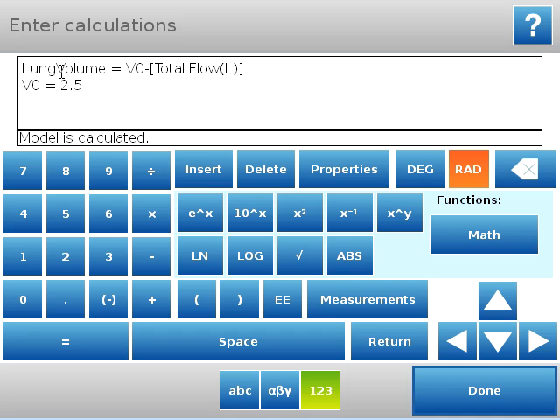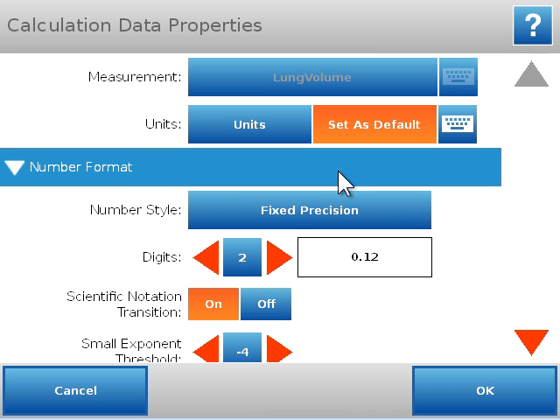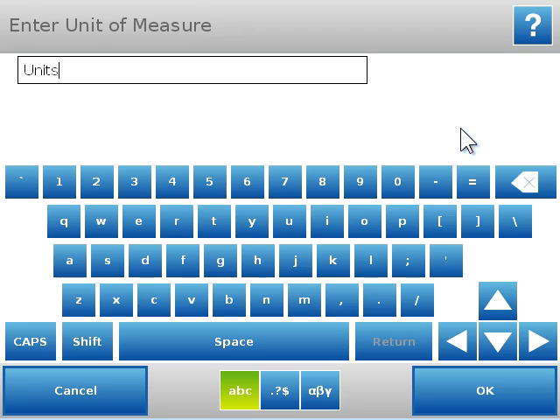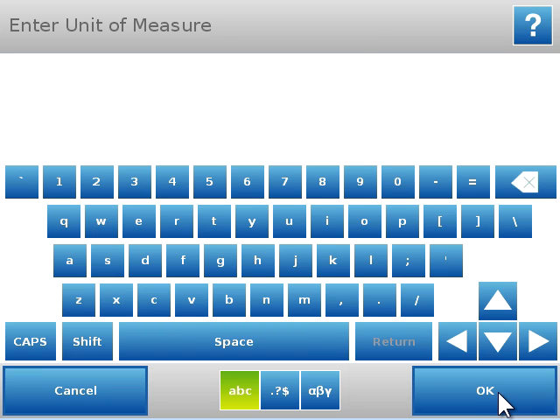Notice I did not put a space between lung and volume. The name that you give your calculation needs to be all one word. I'm going to click back up next to total flow, and I want my lung volume to be in liters. So I need to define that as the property of this calculation. So you can see lung volume as my measurement. I'm going to click the keyboard for units, and I'm going to replace the general default word units with the unit that's specific for this, which is liters.